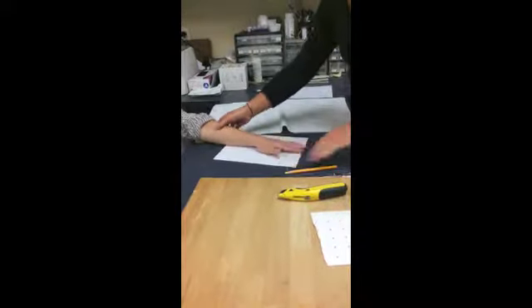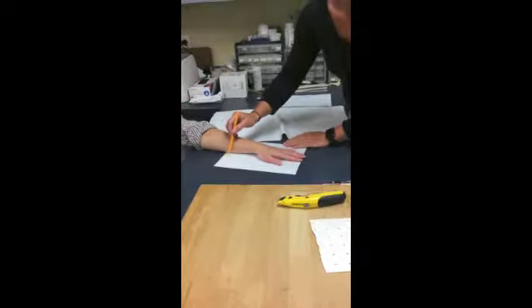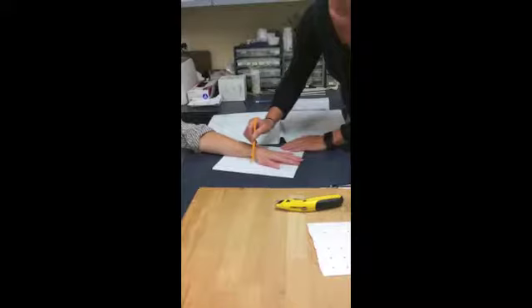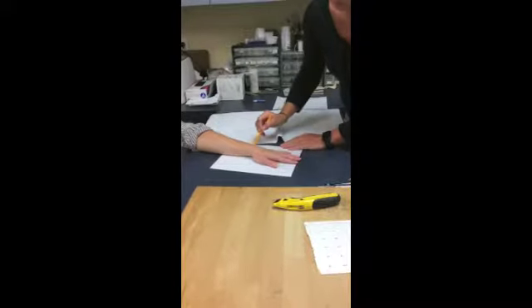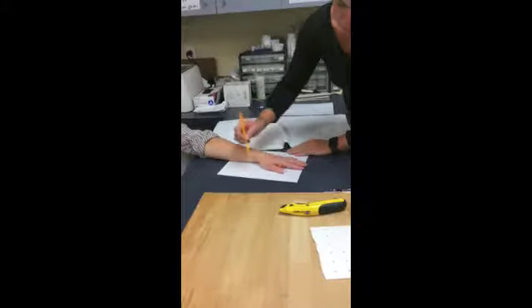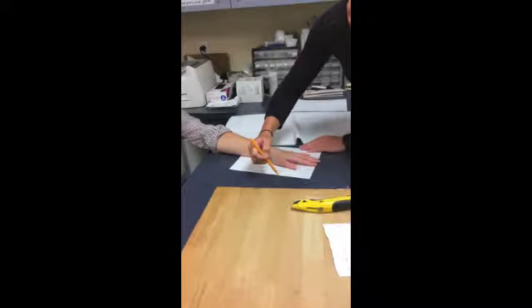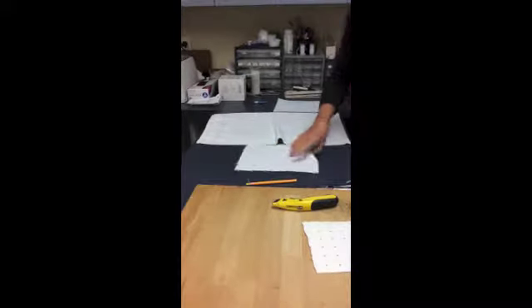So that's what I'm going to do. I'm going to draw up her forearm, those sides, all the way up to about the distal palmar crease, and then make a little part for her thumb. Then I can use this pattern on the thermoplastic material.